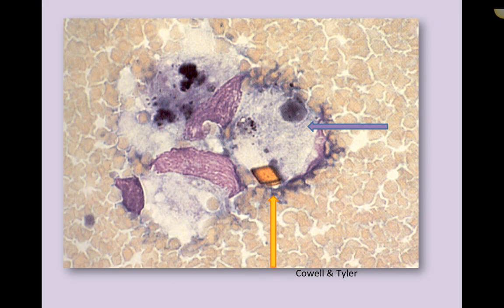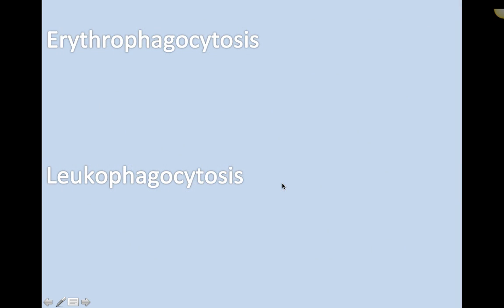Okay, so then we also have macrophages phagocytizing erythrocytes, and we get hematoidin and hemosiderin. Hematoidin and hemosiderin are often seen in red blood cell breakdown. Here's a hematoidin crystal. And then hemosiderin can look orangey brown, could also look a little bit black as well.